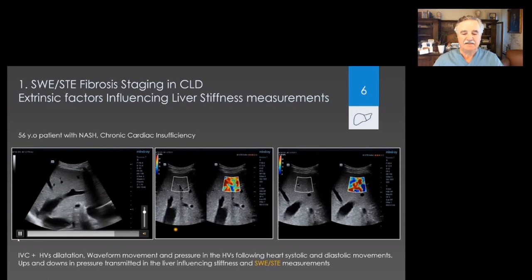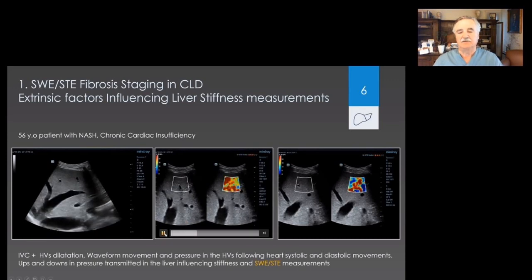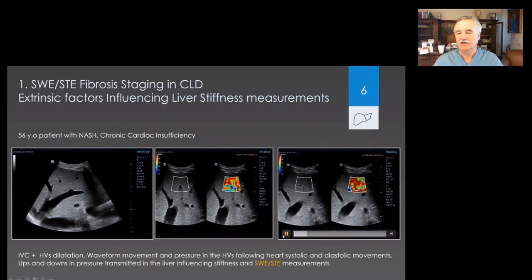And then let's pass to the elastography part of the examination to see that very different elastography numbers arrive. That also counts for the third slide. You can see that numbers in elastography measurements vary between 6 and 25.